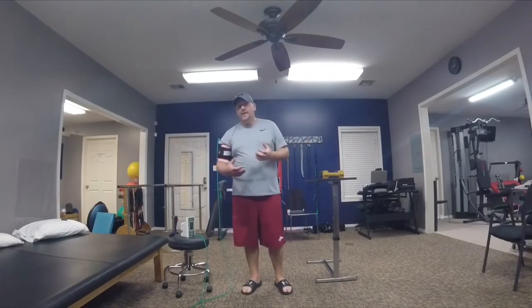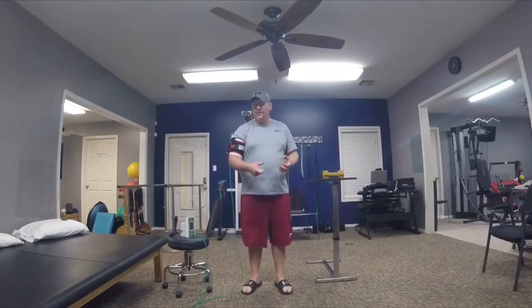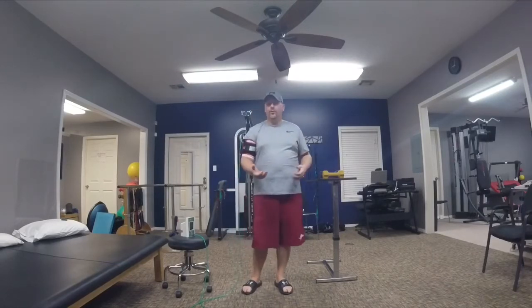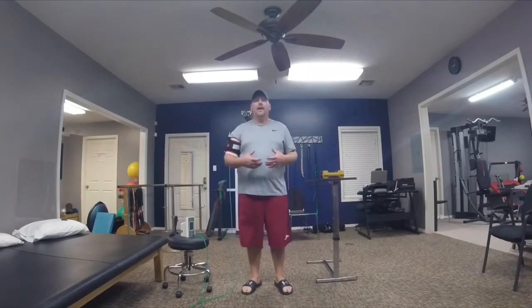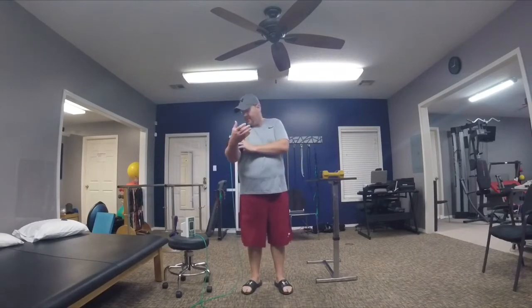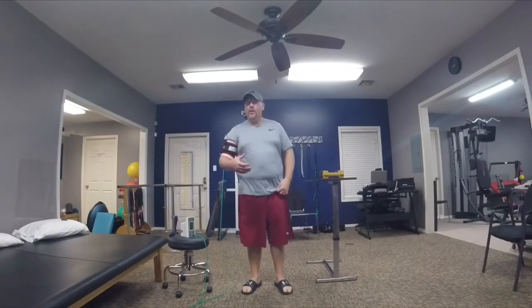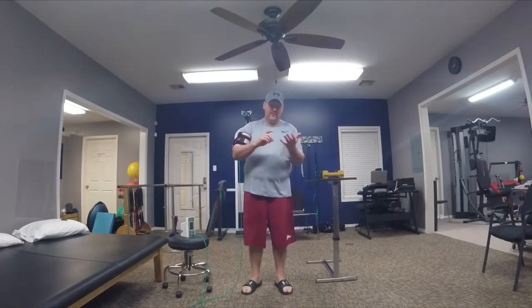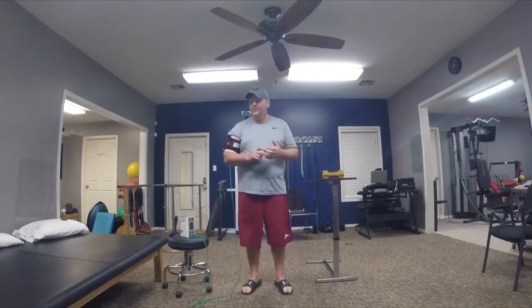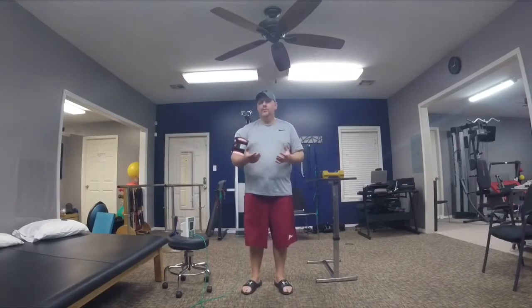Now, what's great about this is that you get the same results using little to no weight as you would having to curl or bench press or squat a lot of weight to fatigue. This way your fatigue comes more in the form of a hypoxic state from the blood flow restriction machine versus the actual weights. With that you get increased growth hormone. The muscle builds back bigger without having to tear itself down first. So there's a lot of really cool benefits to this.